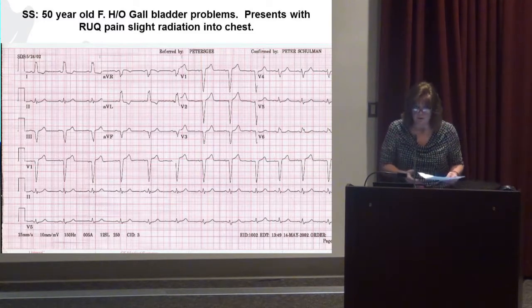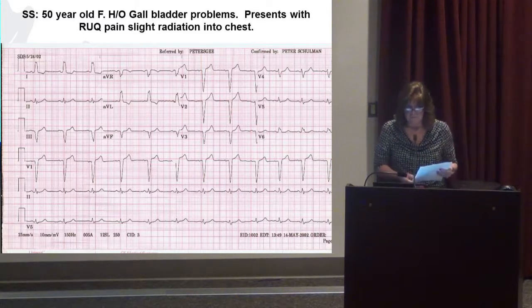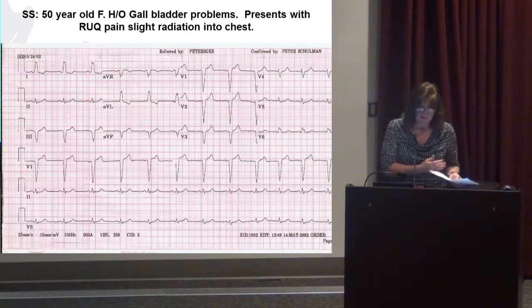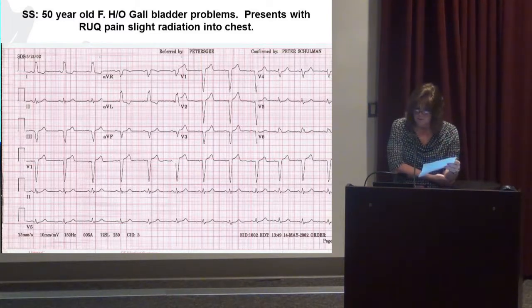Then I'm more concerned. Okay, because if it's brand new, maybe she is having a cardiac event. But I just can't see it. But if it's old and she's had this bundle branch block before, I'm not that concerned. Okay? But you also notice that she has Q waves in the inferior, anterior, and septal leads, which suggests to me that maybe she's had a cardiac event or MI in the past. Okay, so this one needs a little more investigating.